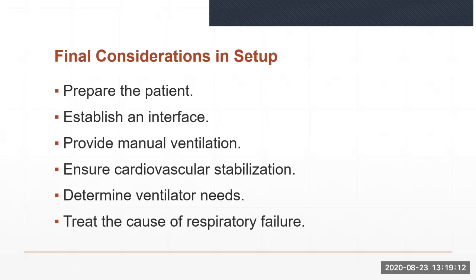The clinician should give a brief explanation about how the ventilator works and why it is being used. The patient must also be informed that the use of an artificial airway will inhibit verbal communication. Unconscious patients should be informed about their situation as soon as they regain consciousness. This is crucial because these patients will be unable to speak and may be completely unaware of what has occurred. Often, the explanation will need to be repeated because sedatives and similar agents can alter a patient's mental status.